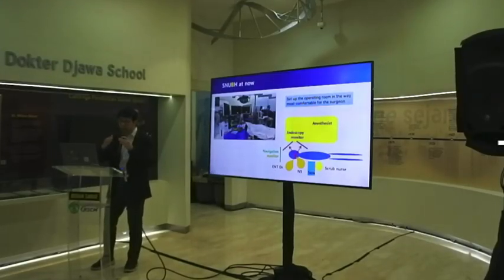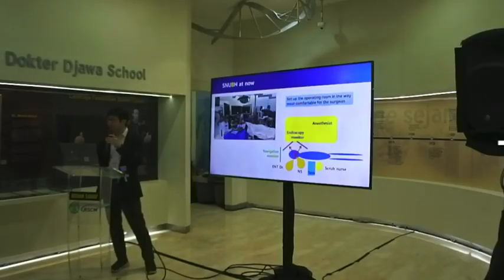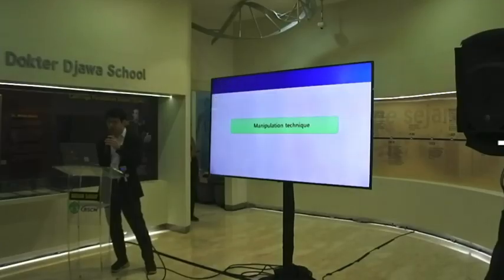When the anesthesiologist sits at the foot side, the air circuit is very long and makes a very large dead space for ventilation. So we changed a lot. The surgical setup is a team alignment, so you should talk with your assistant, the scrub nurse, and the anesthesiologist, and that makes the operating room.